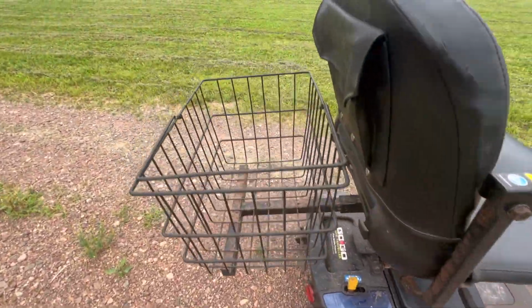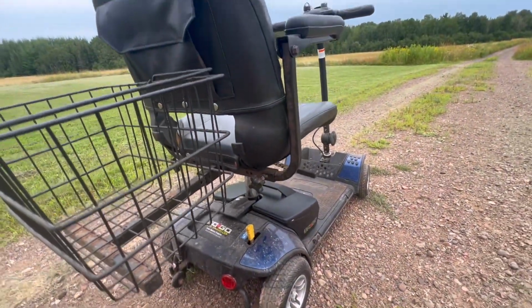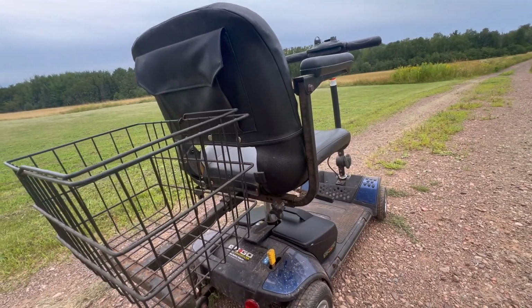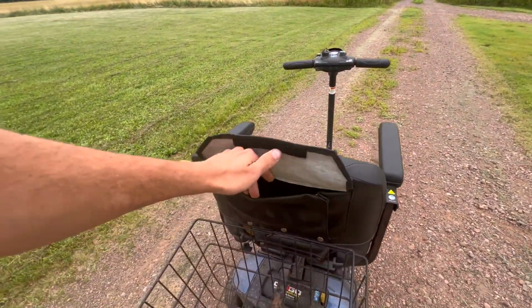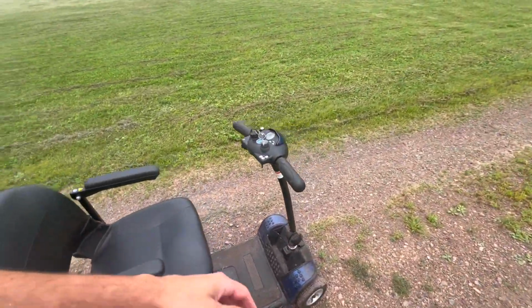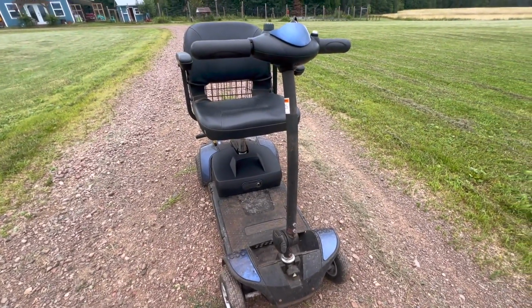The batteries cost me 50 bucks. About an hour of labor. I charge $60 an hour for labor on repairs. So figure $110 into this. You know, we were lucky that somebody donated it, so I don't have to worry about the purchase cost, but I think that we're gonna just donate this to somebody who's in need of it.